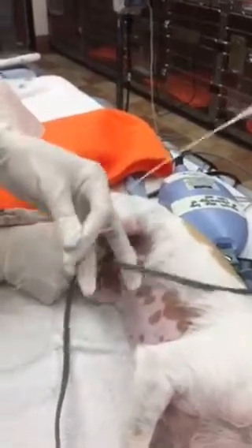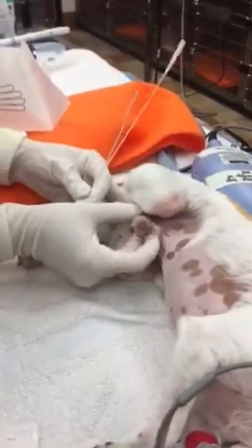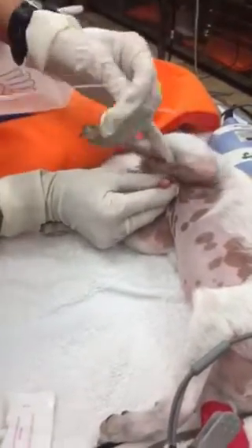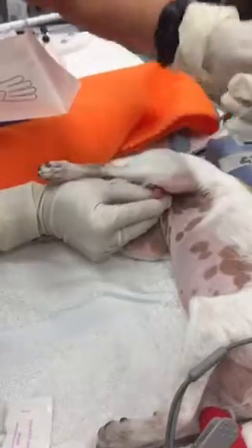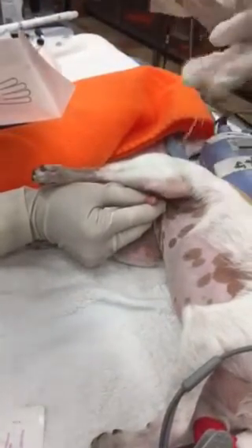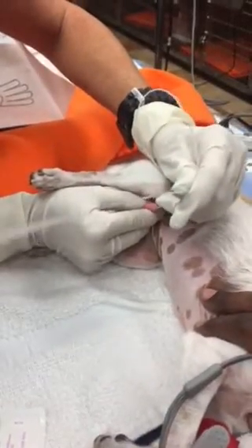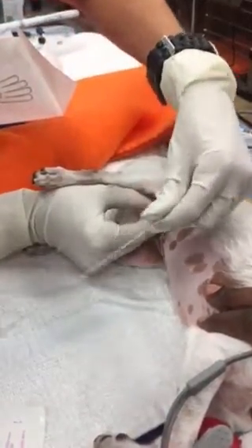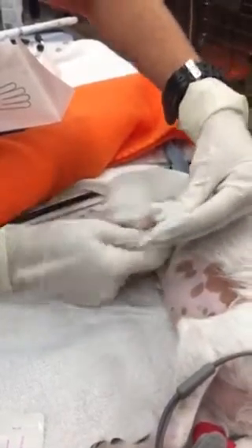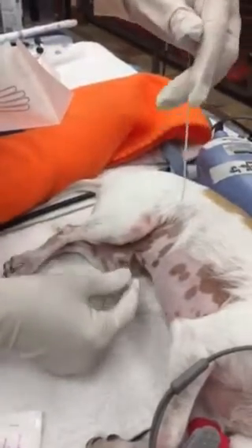This should not be there. I'm going to insert. And once it's in, I'm going to let go and keep inserting until it goes all the way into the bladder.